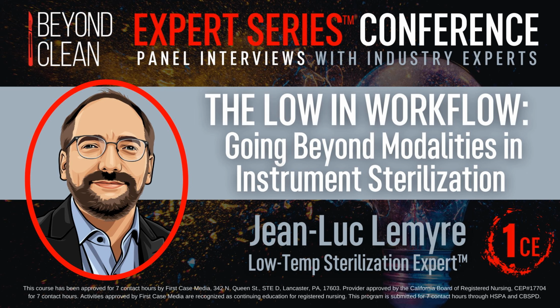Yeah, that's a very good question. I don't know that I fully know the answer, but I think I've got a good guess that it's mostly related to the historical use of low temp sterilizers. Historically, low temp has been created for a niche market of devices that are very complex, that a hospital would not have a ton of to reprocess at the same time and would not want to load one device into a very large chamber, as opposed to steam that has always been doing everything else. So it makes sense to have a large chamber for throughput.